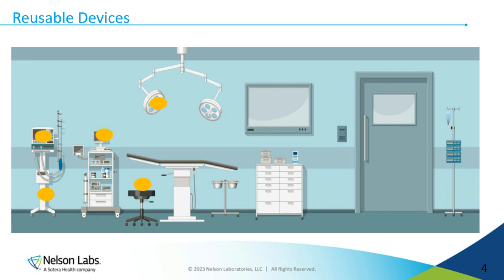And manufacturers usually are not involved in this process. But we're starting to see more and more discussions and more requirements on these non-critical devices that are now being asked to ensure that some sort of validation has been performed and there's efficacy to show that there is safety, right? The two words that FDA likes: safety and effectiveness of the reuse of a device. So those two are very important.